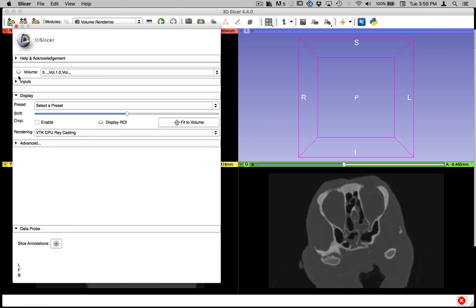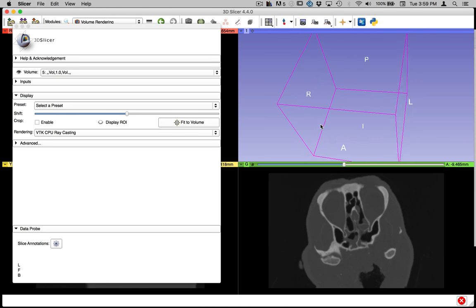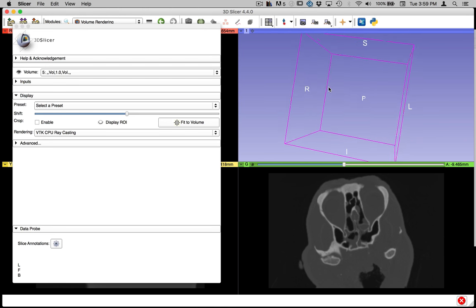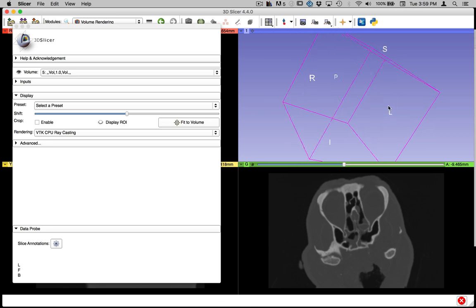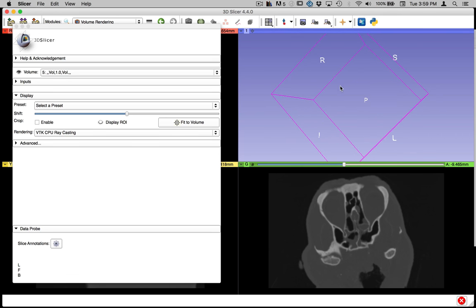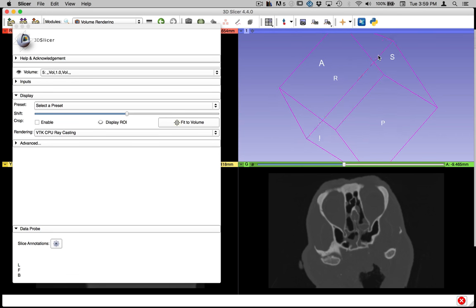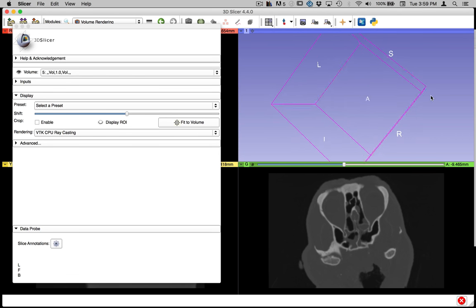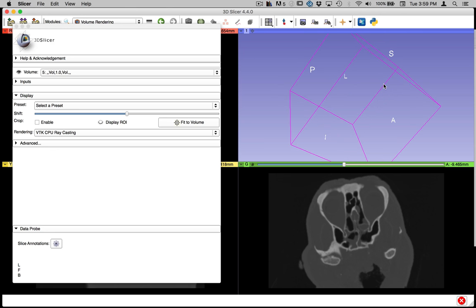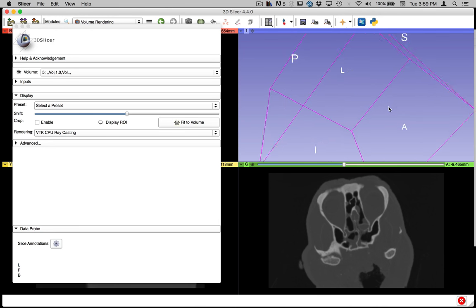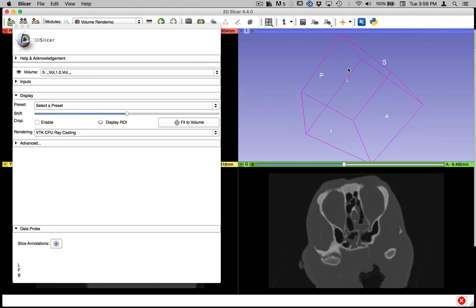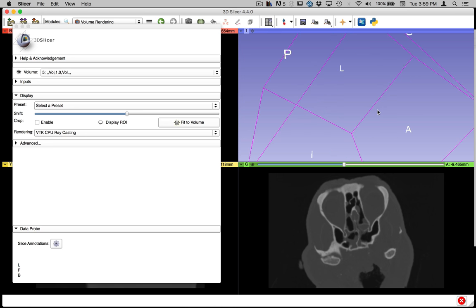And we can turn on, this is a closed eye, click on that, and it will load a 3D representation into this view. Now, it may take some time. It's fairly memory and computationally expensive to do, so you just have to give it some time. But while we're waiting, if you want to navigate around in here, the left mouse button will just tumble your view. So it's different than Maya, you don't need to hold down the Option key. The right mouse button will zoom you in and out.